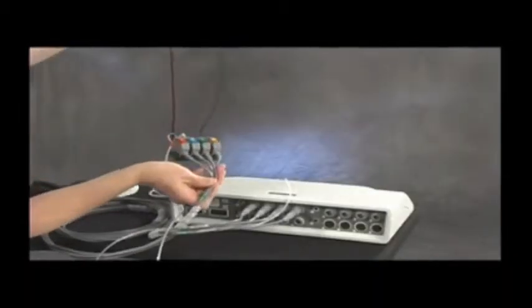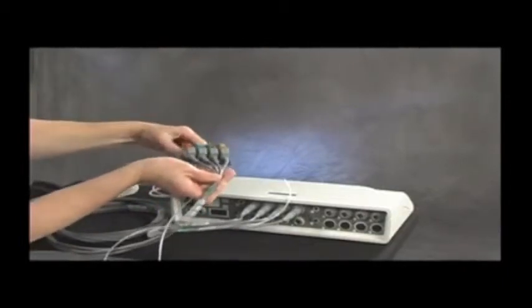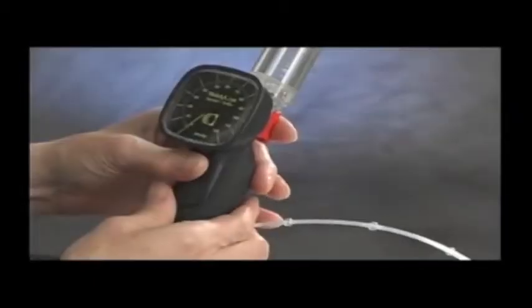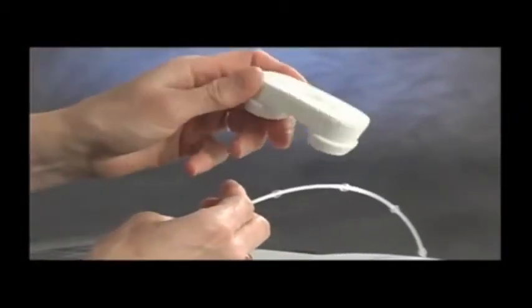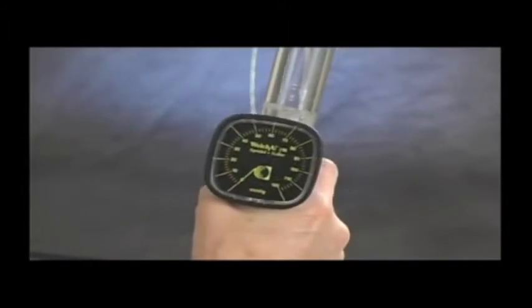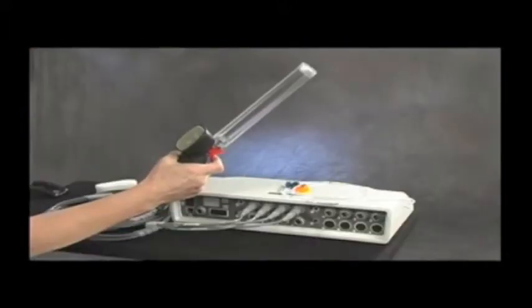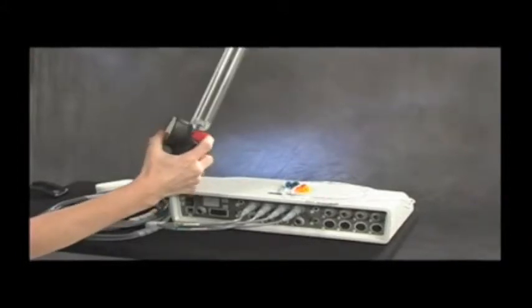Also note the neck cord accessory that is useful in securing the catheter in place during esophageal manometry studies. Next, locate your calibration tube and silicone cap. At the bottom of the calibration tube is the pressure mechanism for the unit: a pressure gauge, a black bulb for manipulating pressure, and a red trigger lever for sealing or bleeding pressure in the tube.